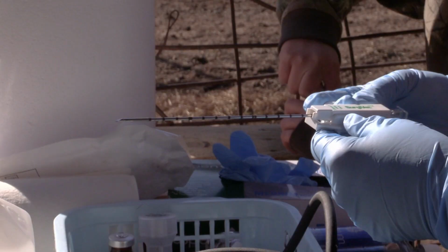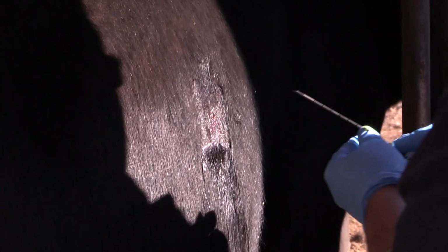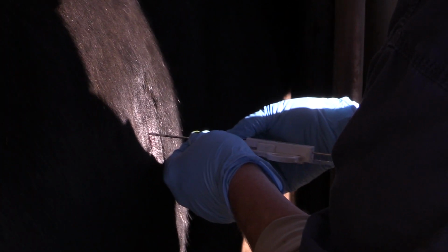Aseptically prepare the spring-loaded biopsy needle. Load the spring-loaded biopsy needle by pulling on the stylet until you hear a click and it stays in place. Insert the biopsy needle through the incision and intercostal muscles to about 1 inch and stop. Redirect the biopsy needle parallel to the ground and slightly forward towards the left shoulder of the animal.